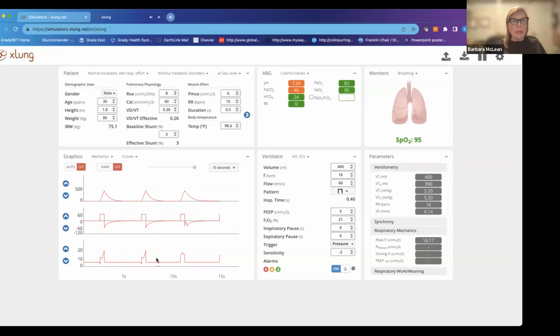Now, you can see here, this pressure graph has changed a little bit, right? This looks a little bit better. Here's your tidal volume, here's your flow, and here's your pressure, okay? And you can see right here, my patient had a very significant double hump. That kind of concerns me that he's got a double hump. He's a little dysynchronous with my ventilator. Okay, so again, minute ventilation, V subset E, minute ventilation 6 to 10.